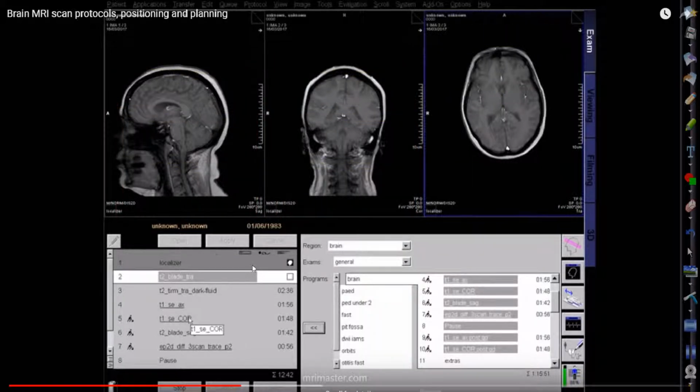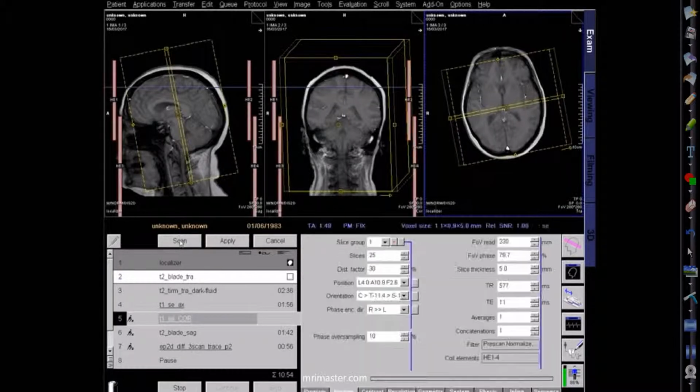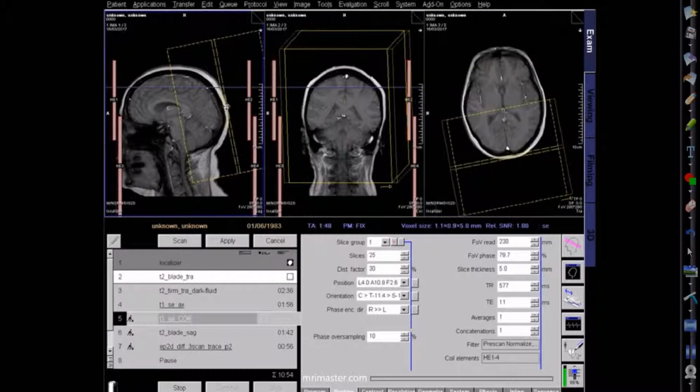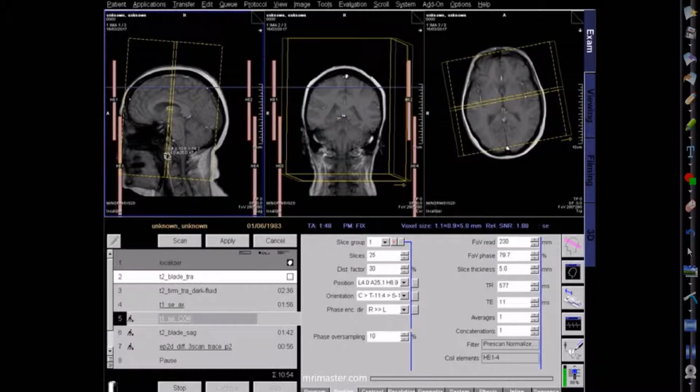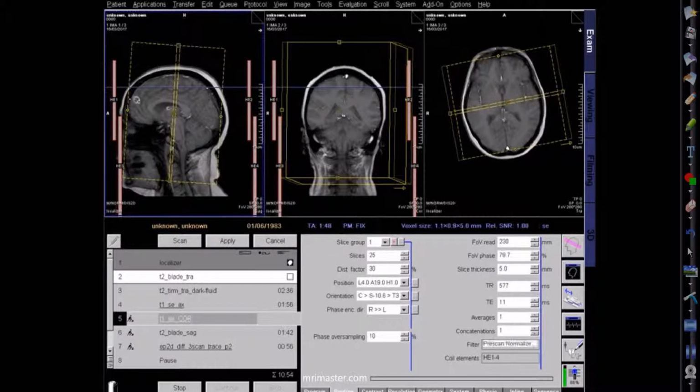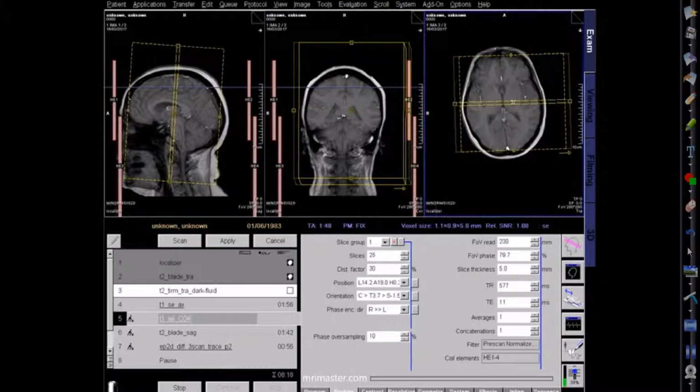Now plan your coronal sequence using all 3 localizer planes. On the sagittal localizer, the coronal slices should run perpendicular to the line from the genu to the splenium of the corpus callosum. Ensure that the slices cover the entire brain from frontal sinus to the posterior occipital lobe. Center the image in the coronal field of view. Plan the sequence on the axial view. The slices should run perpendicular to the midline of the brain, with the center point lying over the midline.